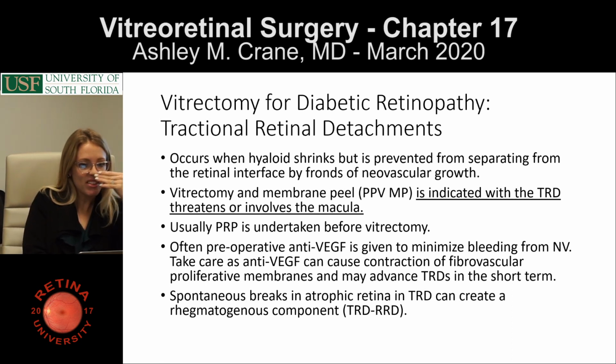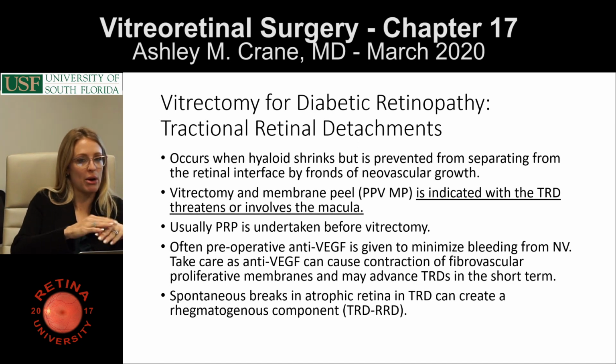Okay, so the surgery, and I'll show you a quick video of a small detachment in a minute, but surgery involves basically removing the cortical vitreous, separating the posterior hyaloid from the retina, and then trimming down or removing the adhesion. We call them pegs. Removing the adhesions with a variety of instruments, using endodiathermy to prevent or stop bleeding. And oftentimes, but not always, you can use a tamponade like gas or oil. And you don't have to necessarily do that unless there's a hole in the retina.